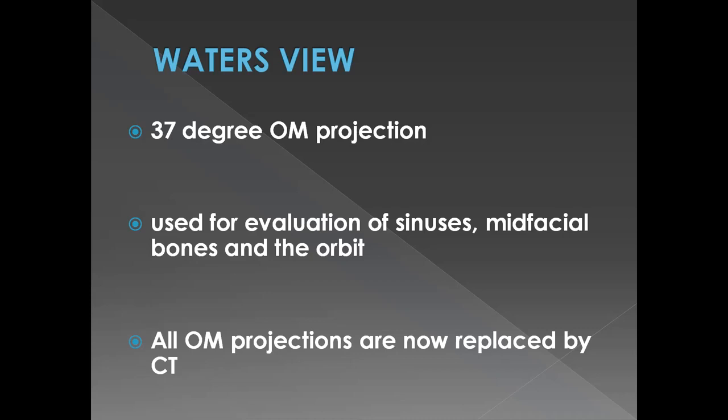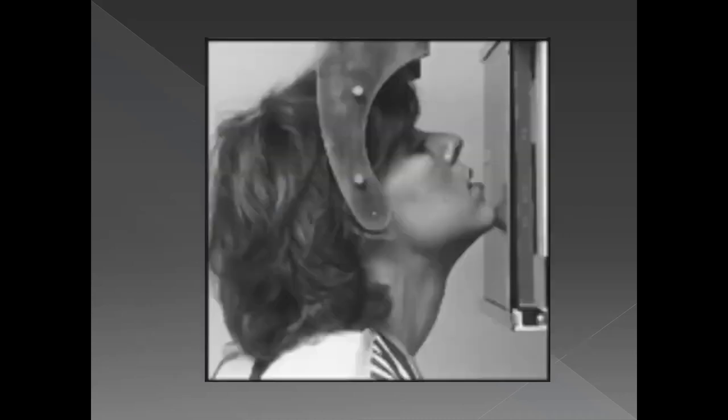But obviously, due to patient finances, it may not be possible for you to order a CT for every patient who has a mid-face trauma. So you might have to rely on these X-rays in order to make your diagnosis. But still, for this reason, I'm telling you which X-rays will be most beneficial to you in order to catch a fracture and make your diagnosis.